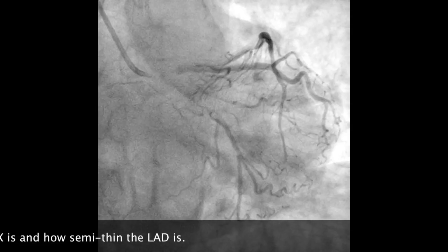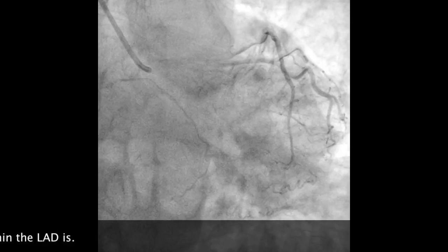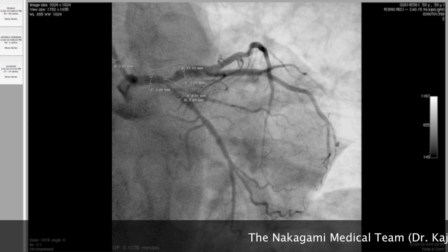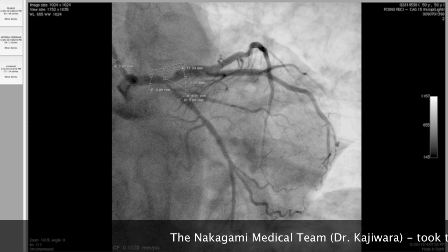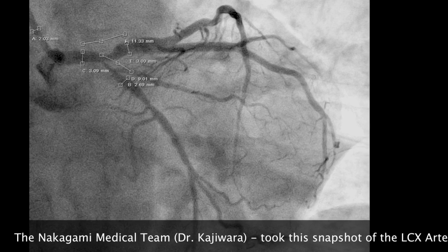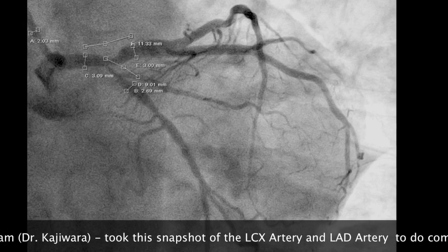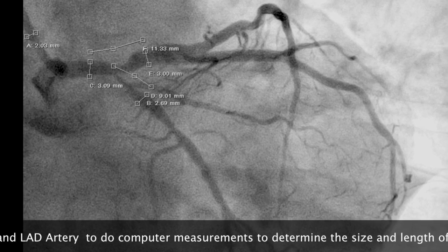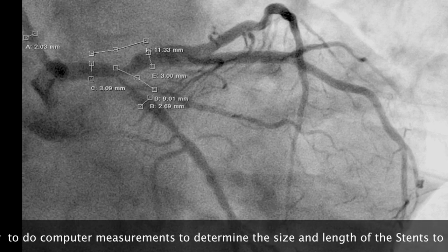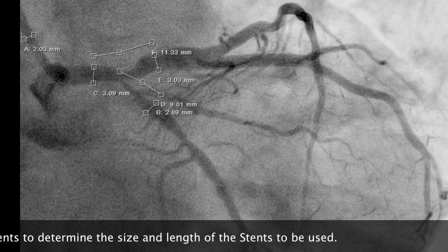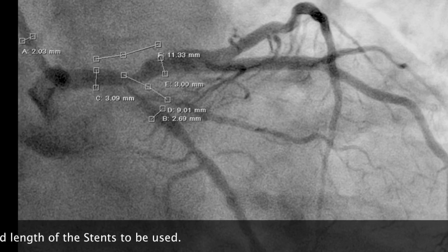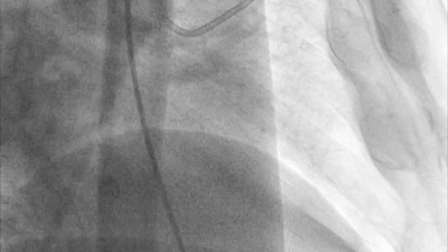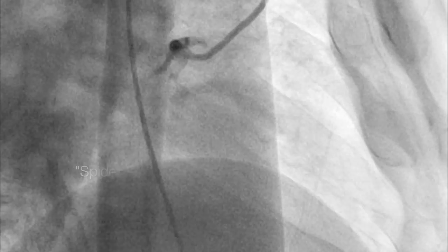Now we're looking at the LCX — please note how thin the LCX is and how semi-thin the LAD is. Dr. Kajiwara and the medical team took a snapshot of the LCX and LAD arteries to do computer measurements to determine the size and length of the stents to be used.